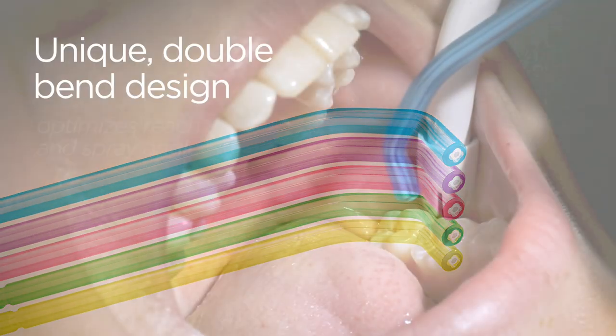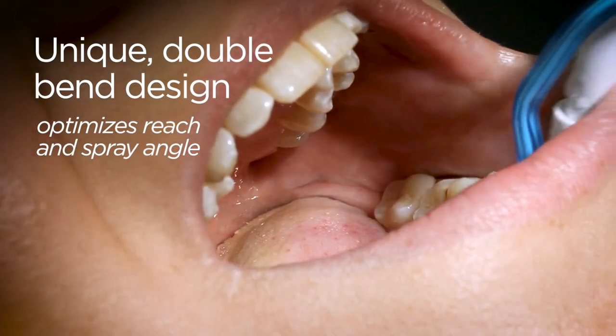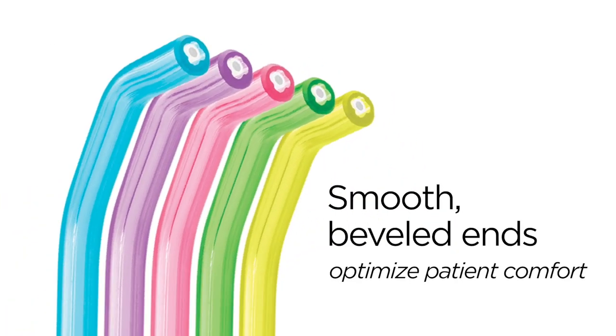Hi, David from Practicon here to tell you about PractiTip Air Water Syringe Tips. Developed by a dentist, disposable PractiTips feature a unique double-bend design to optimize reach and spray angle on back teeth without affecting anterior technique. PractiTips are available in assorted neon colors and feature smooth beveled ends to ensure patient comfort.